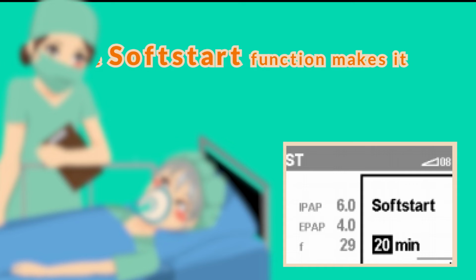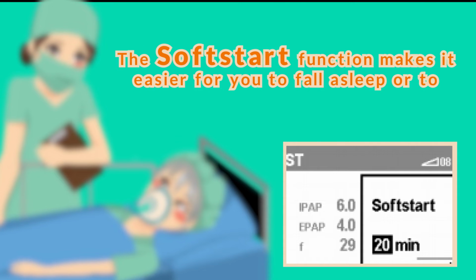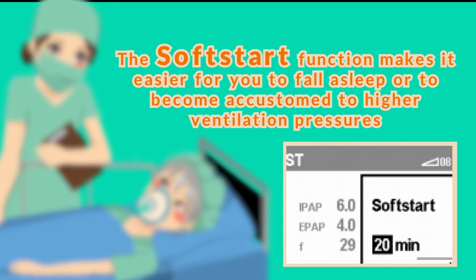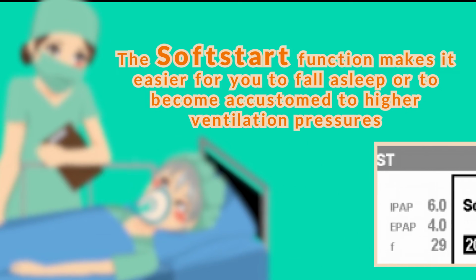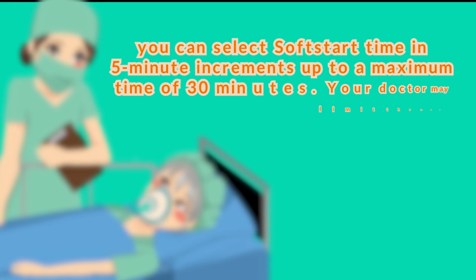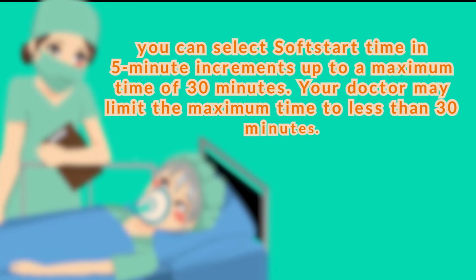The soft start function makes it easier for you to fall asleep or to become accustomed to higher ventilation pressure. If soft start is activated, pressures gradually rise to your therapy level. If your doctor has enabled the soft start function, you can select soft start time in 5-minute increments up to a maximum time of 30 minutes. Your doctor may limit the maximum time to less than 30 minutes.